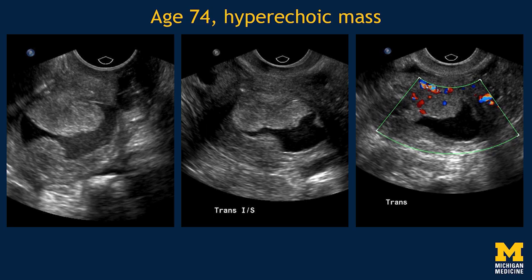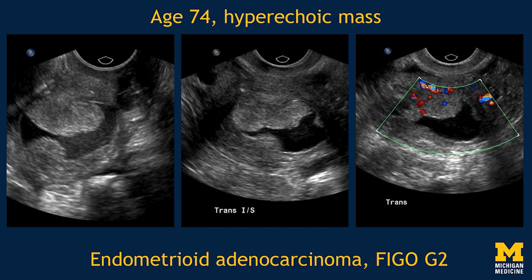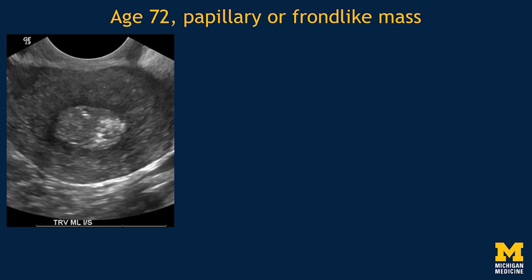Here's an example of a morphology which should be worrisome, particularly in a postmenopausal woman. Subendometrial leiomyomas tend to be hypoechoic because their echogenicity follows that of the myometrium. In endometrial origin lesions, such as polyps or carcinoma, the echogenicity follows that of the endometrium. So a hyperechoic mass usually comes from the endometrium, not the myometrium. In an older woman, this is highly likely to be a carcinoma. In this case, it was an endometrioid carcinoma, FIGO grade 2.